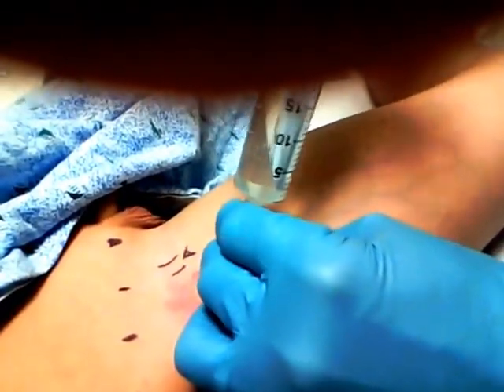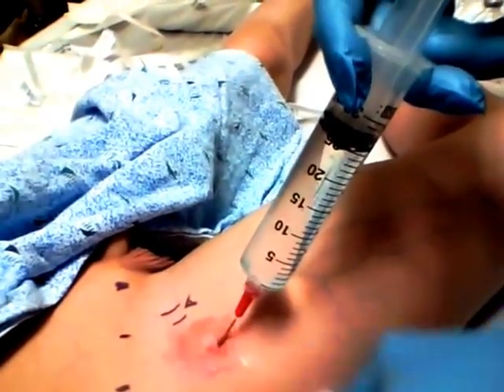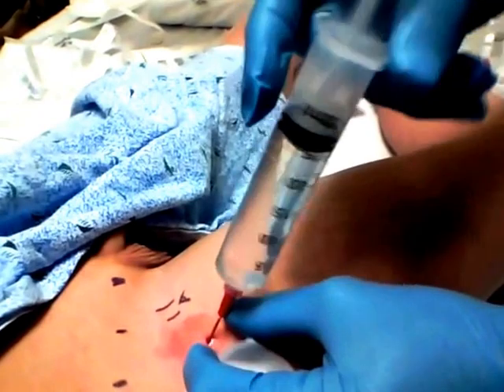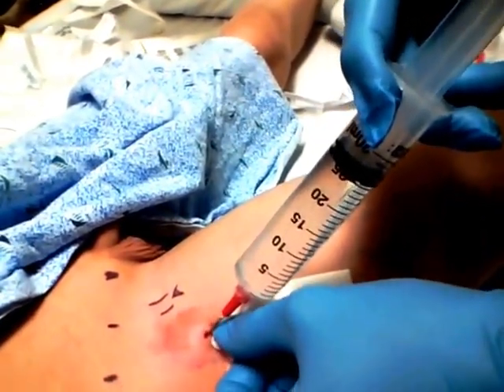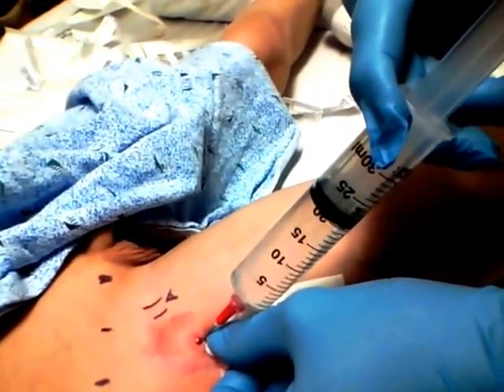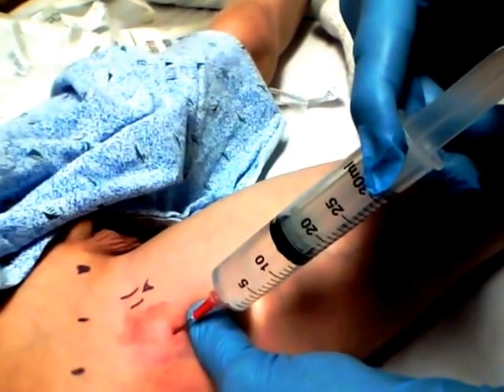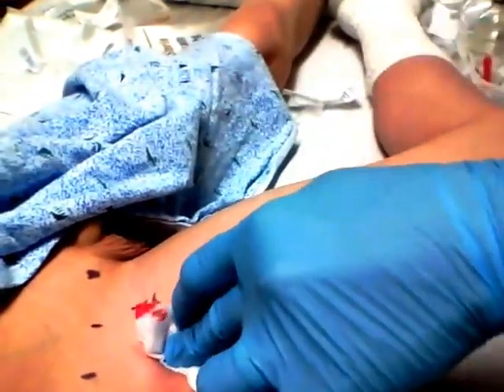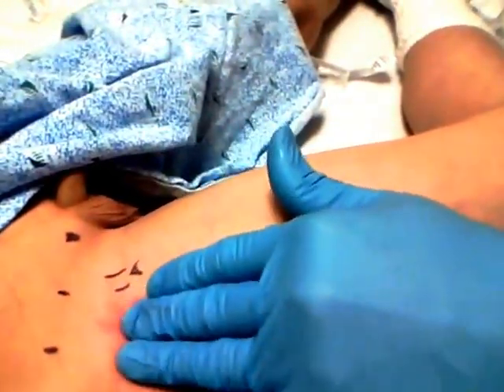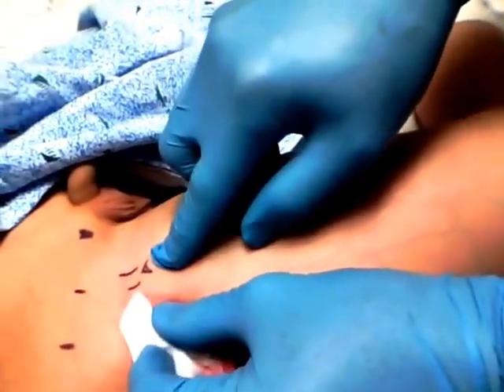Now I'm going to inject the bupivacaine and we shouldn't feel any resistance at all as we inject. I'm feeling a little bit of resistance, so I'll reposition slightly — and now we're getting no resistance at all. We put a little pressure distal to it so that it runs more cephalad. The bupivacaine is in. You can see there's no wheal at all here, so everything went into the fascial plane and up into his leg. We aspirate to make sure we're not in any artery, but there are clearly no vessels here because the artery is over here.